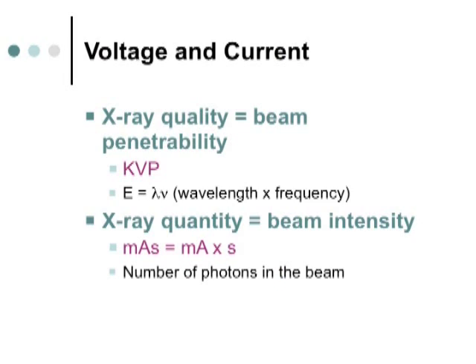So in an X-ray machine, there are two circuits. If I'm going to take an X-ray, I have to decide how much voltage I'm going to give a person, how much kilovoltage, I'll set that, and then how much amperage. The higher the kVp is, the shorter the wavelengths are going to be, and the shorter the wavelengths, the more penetrating they are.